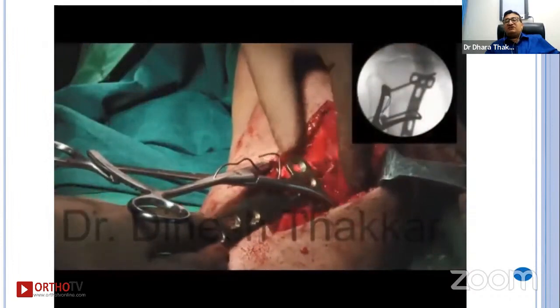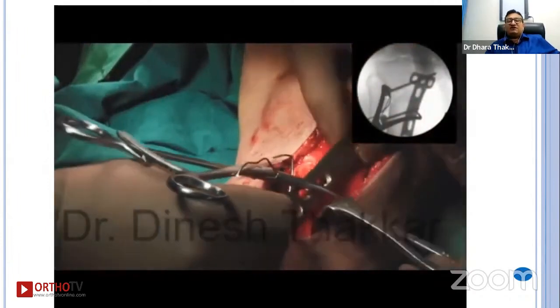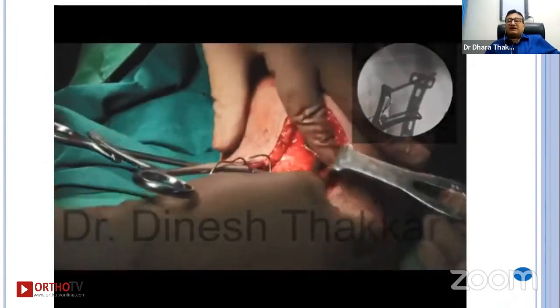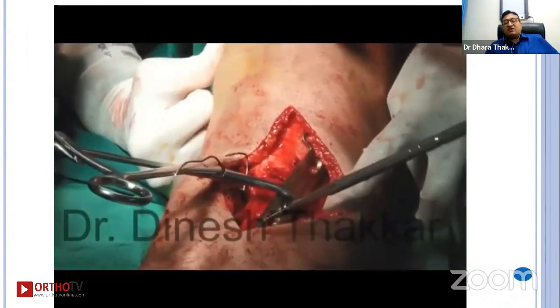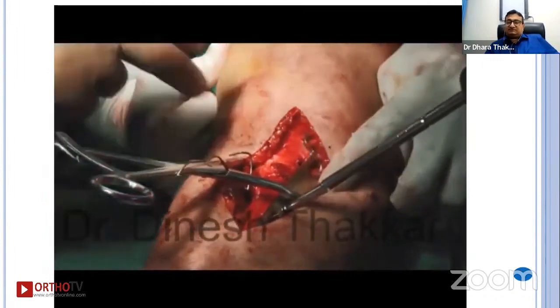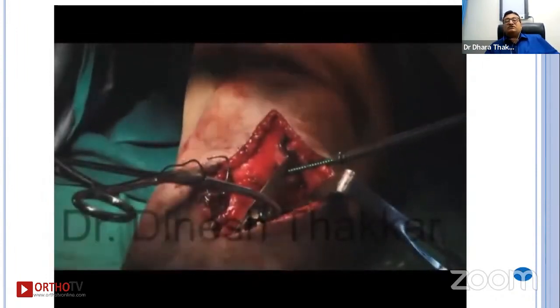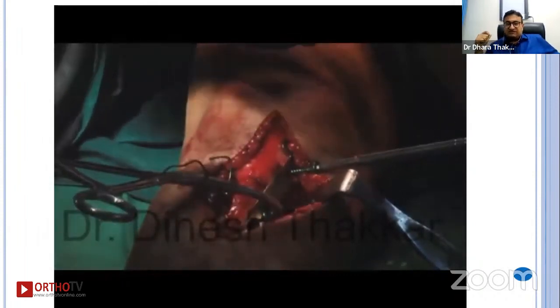And then I fix on the medial side with the medial locking plate. Any plate we can use, but usually I am using Tomofix because it is an angle stable implant and very strong implant. First I pass the cortical screw in the distal fragment. After that, one cortical screw in the proximal fragment, if I get a space.